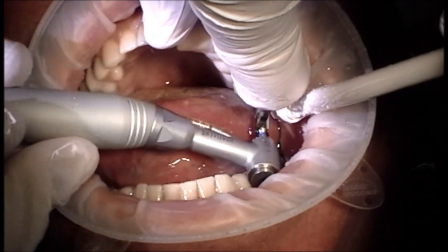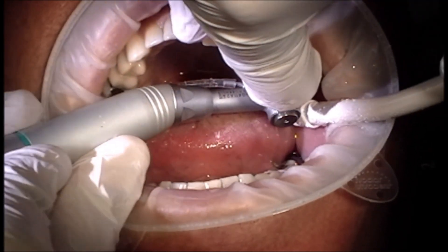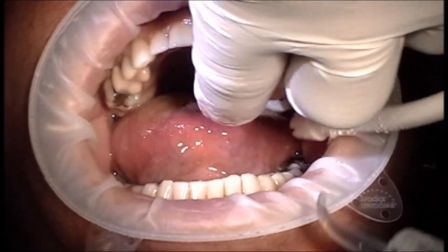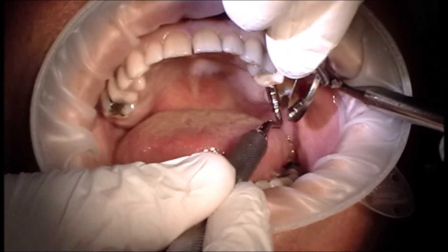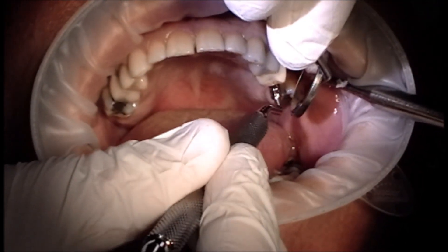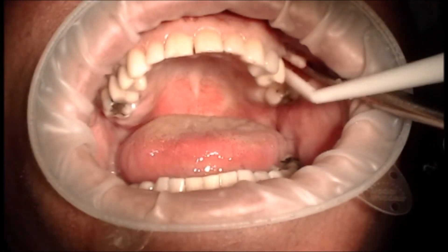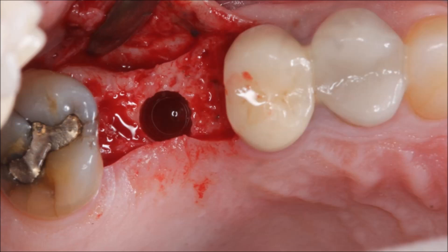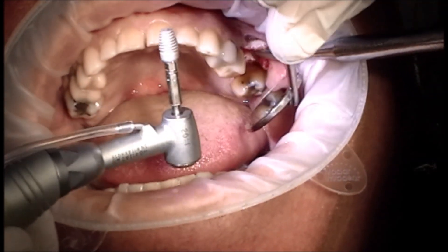This assumes that you're using the Blue Sky Bio handpiece — the X-Cube handpiece — and their one cut drill system. Everything is pre-programmed for those. That was the completion of our osteotomy — you'll notice it was very quick. I'm taking an instrument into the osteotomy making sure that there's no sinus perforations, and just as planned, there was not. It was to the full depth. Here you see the osteotomy exactly where we planned it.